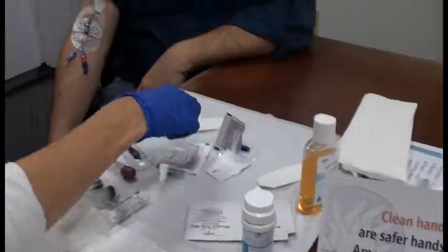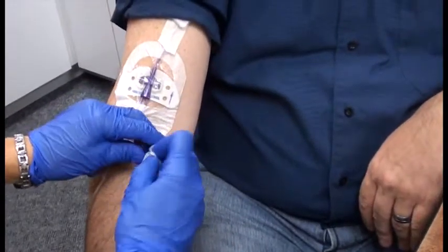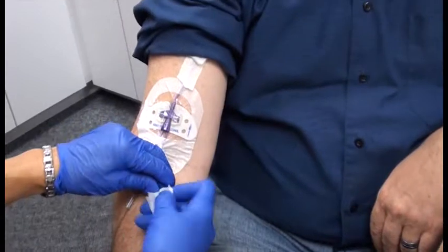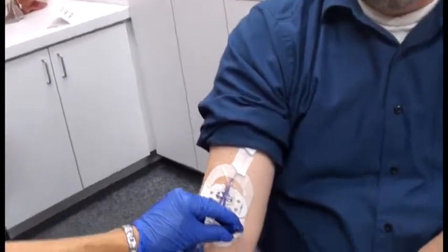Good. Okay, so I'm going to get an alcohol wipe and I'm going to wipe it about 5 times. That's a juicy alcohol wipe, right? Yes, it is. And I'm going to let it dry.